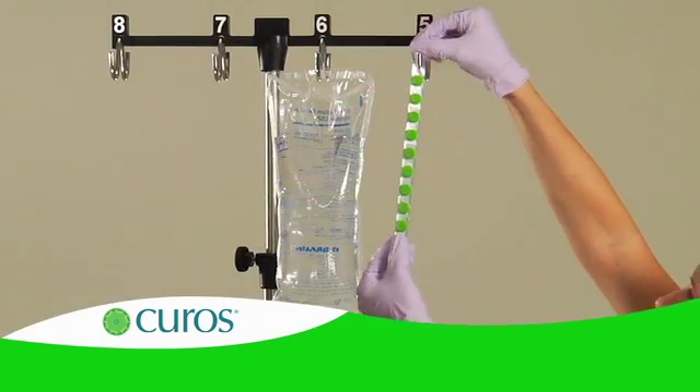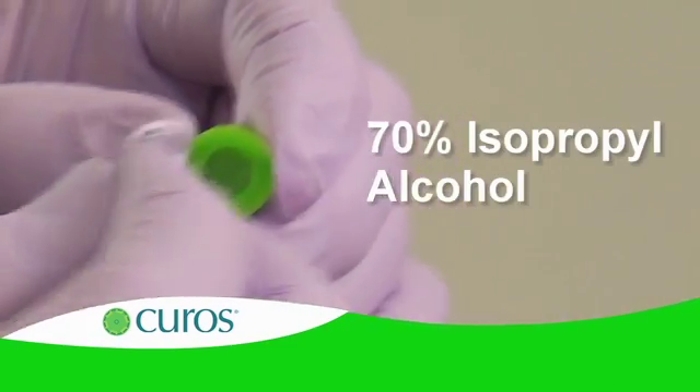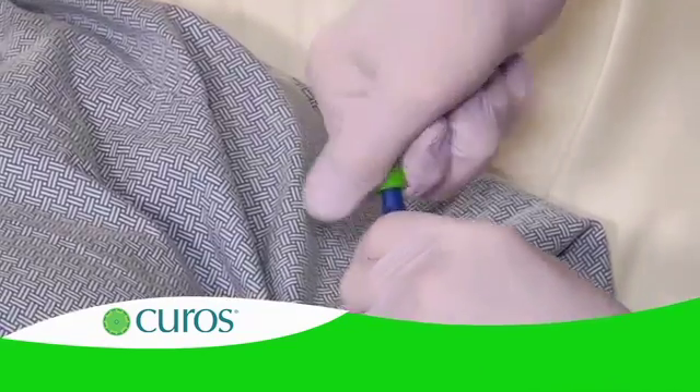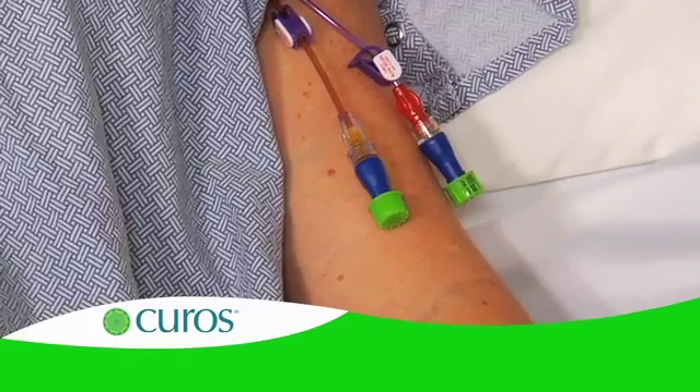Each CUROS port protector contains 70% isopropyl alcohol and a medical-grade foam pad. CUROS passively disinfects and protects IV injection ports. It is designed to reduce the risk of introducing microorganisms into the bloodstream through the needleless connector.